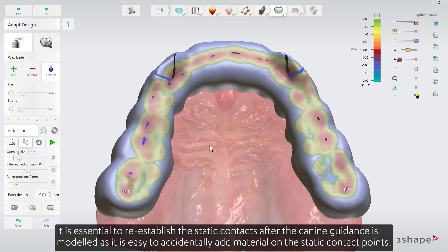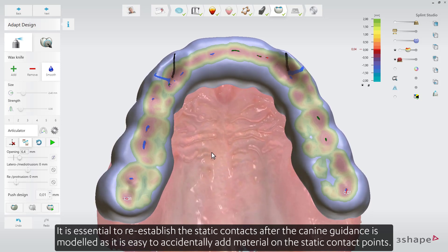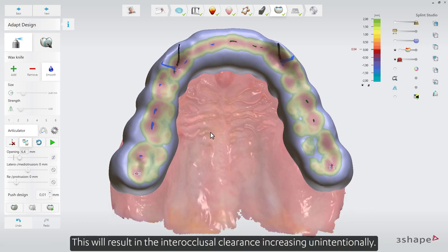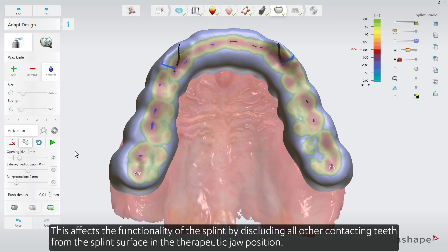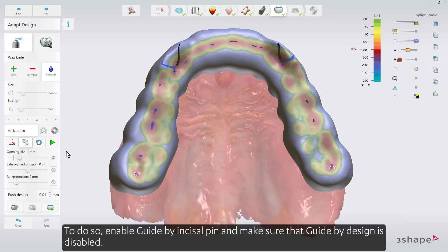It is essential to re-establish the static contacts after the canine guidance is modelled, as it is easy to accidentally add material on the static contact points. This will result in the inter-occlusal clearance increasing unintentionally, affecting the functionality of the splint by discluding all other contacting teeth from the splint surface in the therapeutic jaw position. Repeat the following procedure whenever material has been added or removed in the proximity of static contact points.